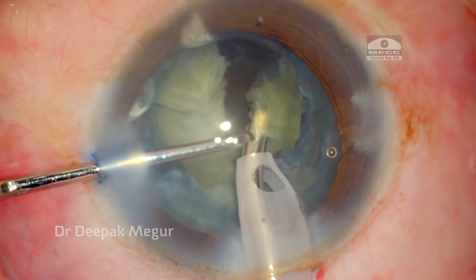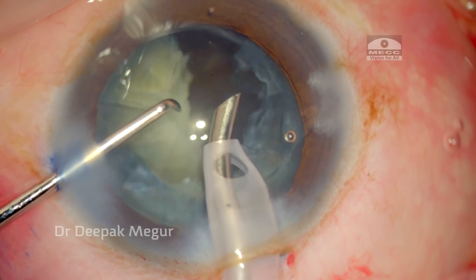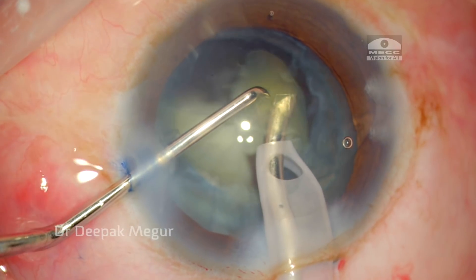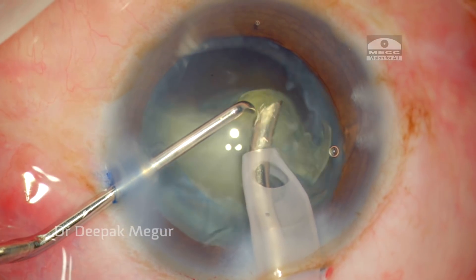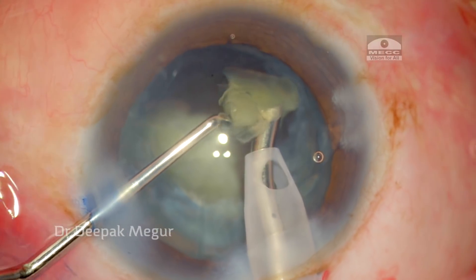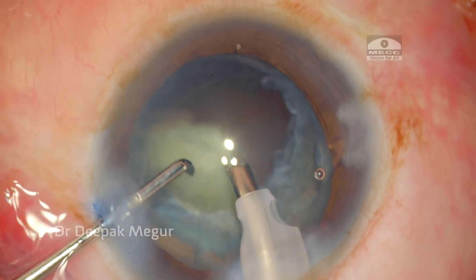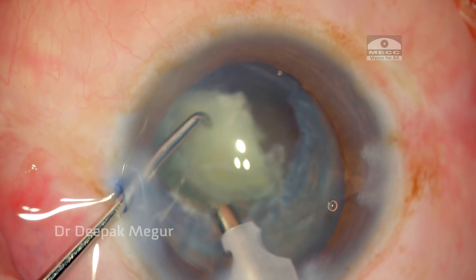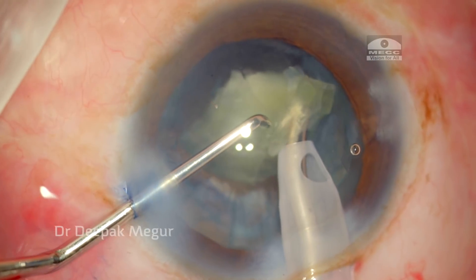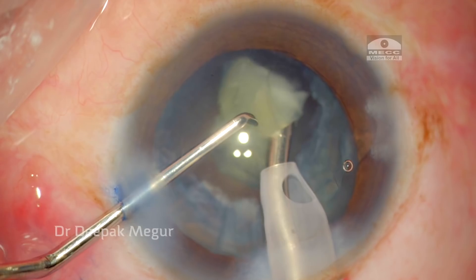I again engage the nuclear fragment, pull it out of the bag, and emulsify. The phaco part was actually the easiest step in the entire procedure because the nucleus was very free and of the right density — easily choppable. Now I expect the most difficult part will be the aspiration and removal of the epinucleus.